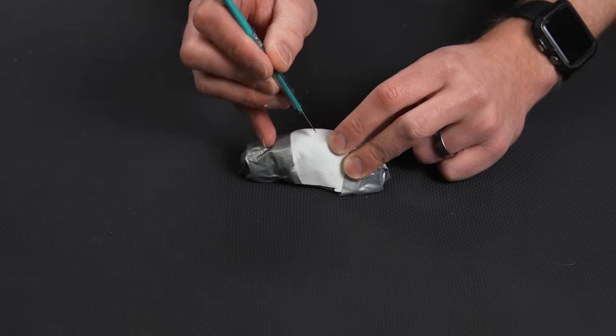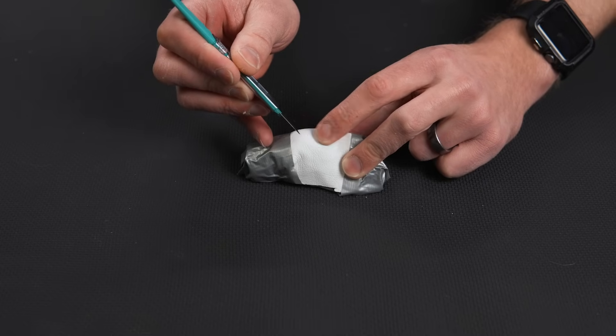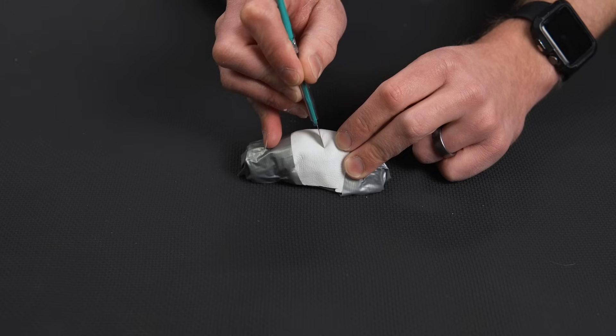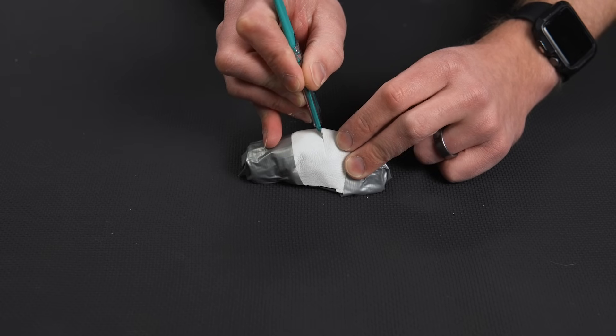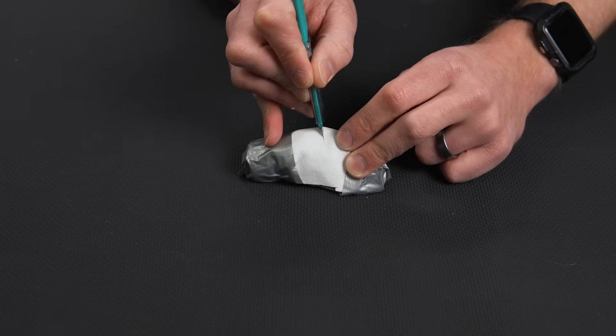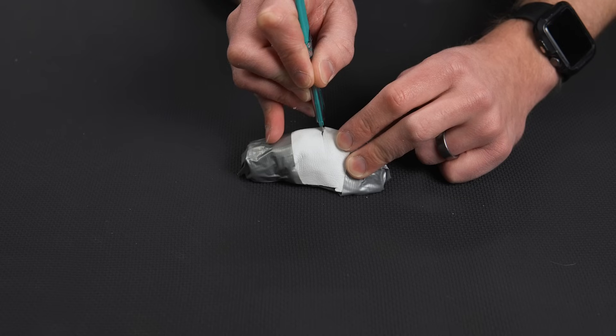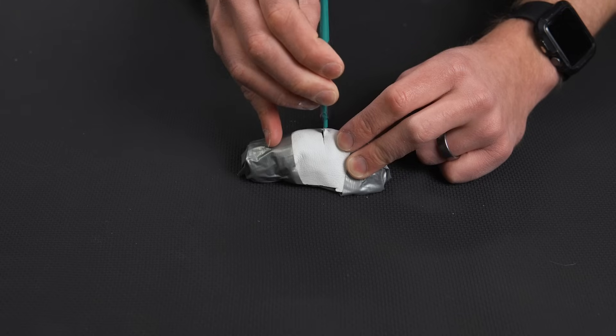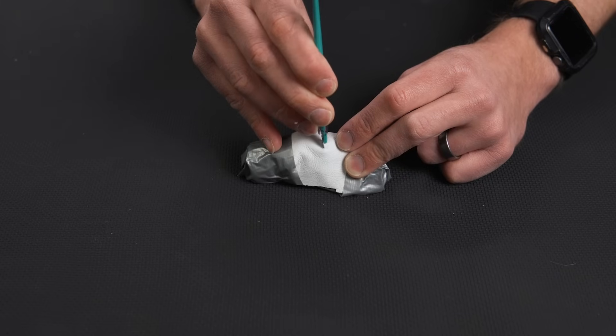So to do this one here, we found the landmark, sterilize the site as appropriate, and I'm going to take the scalpel and we're going to make a cut down into the membrane. I'm going to take it all the way to one side of the membrane and the skin. It will stop once again. I'm going to twist the scalpel 180 and I'm going to move to the other side.